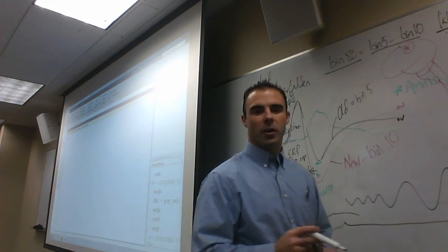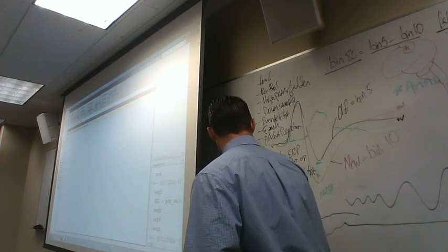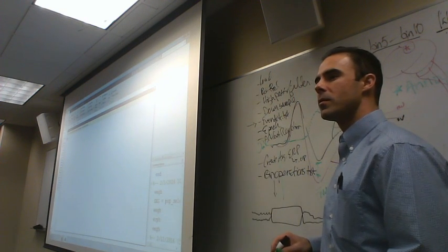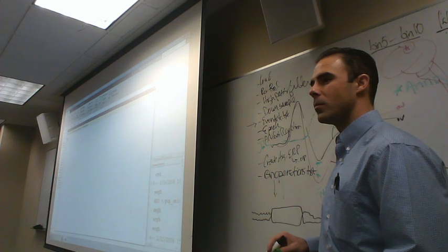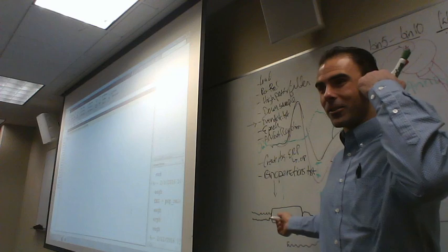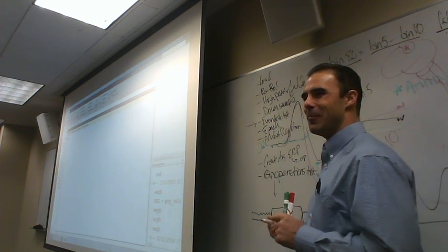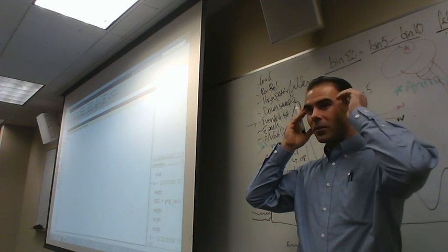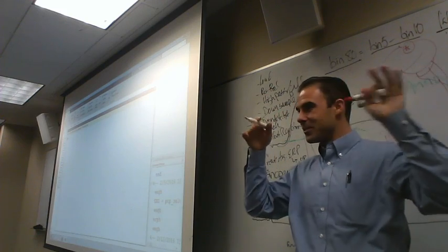What if you had one that looked like this? Would it be a blink? It's a saccade. It's the other electrode, guys. Just the same thing. Because remember, we record from both sides. So if you look left, this one's going to be going this way, but this right electrode is going to be going here, right? So it's now the same thing.